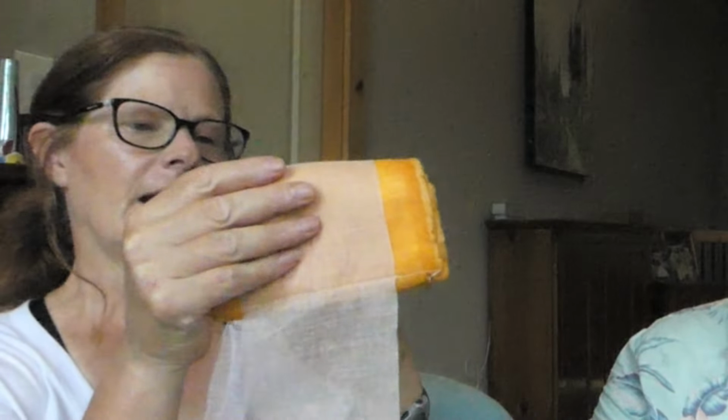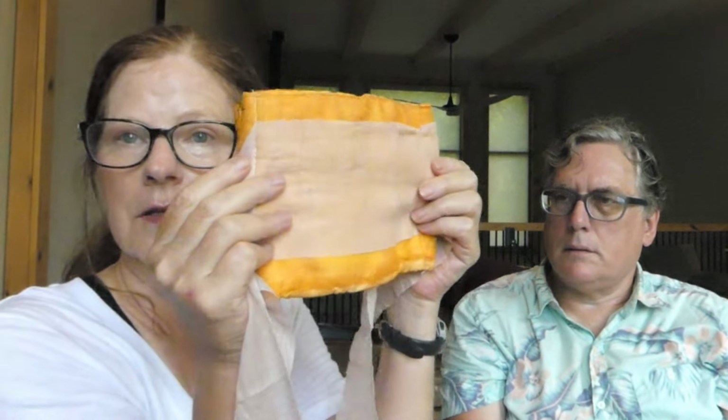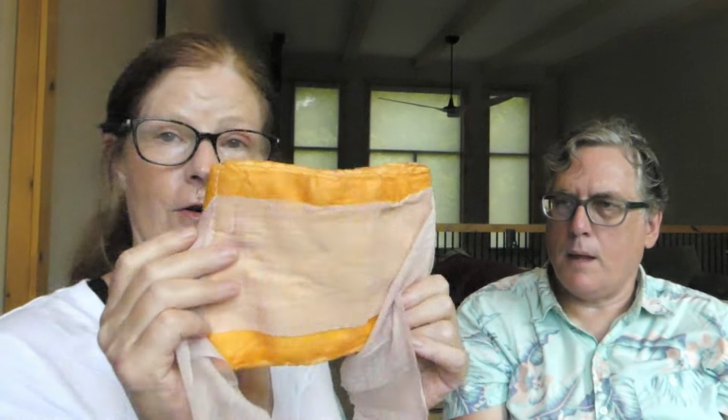It's got some pluses. In modern times, in hospitals, we usually have 2 or 3 pieces to get this kind of thing. So putting it all together like this, you know, we'd have a cling, we'd have tape, whereas you can just tie this. We'd have little things perhaps to fasten it. So this is all that in one. Instead of having 3 different things you have to open, this is ready to go for a variety of wounds.